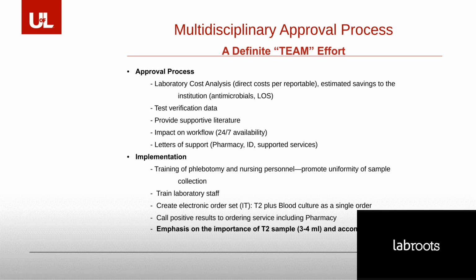Test verification data was generated. We also provided literature support in terms of working with the administration. We also had to look at the impact on workflow. We were fortunate to be a 24/7 dedicated microbiology staff, and workflow has not been a problem.